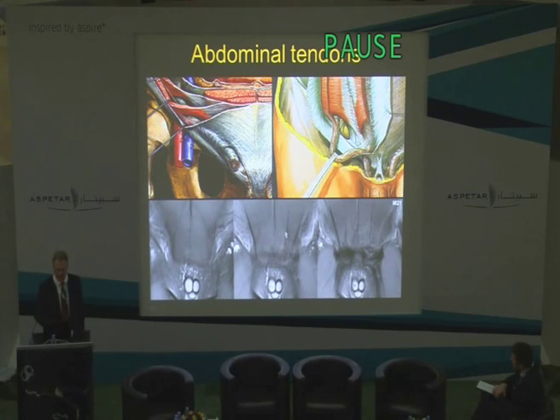Now, these things are all interlinked, and if you look at MRI plus ultrasound together in these chronic groin patients, virtually none of them have an isolated lesion. They are always abnormal at both the abdominal end and the lower limb end. So even when the patient has purely pain at the abdominal end or purely pain clinically at the adductor end, on imaging we see pathology at both ends of that construct, and it's only logical because they are intimately connected mechanically.